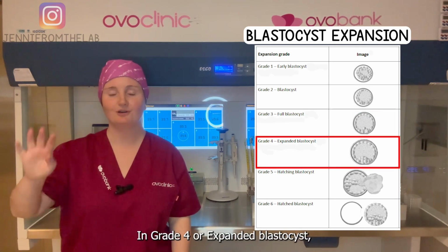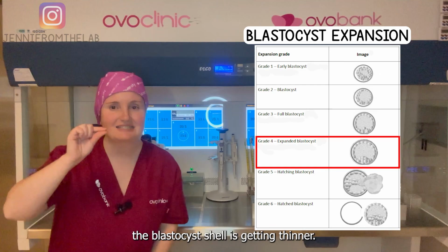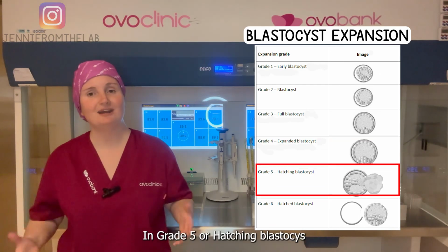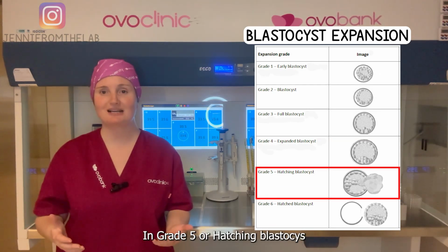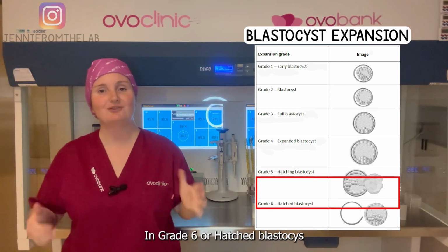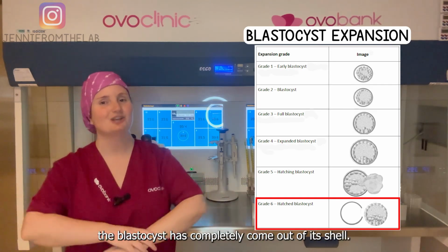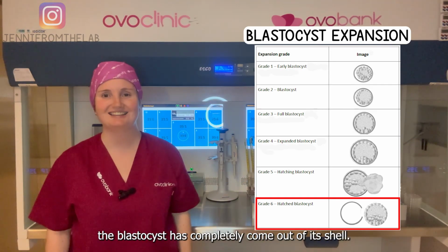In grade 4, or expanded blastocyst, the blastocyst shell is getting thinner. In grade 5, or hatching blastocyst, the blastocyst is starting to come out of its shell. In grade 6, or hatched blastocyst, the blastocyst has completely come out of its shell.